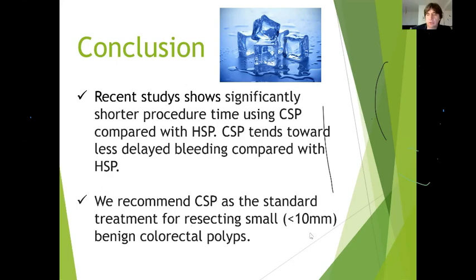From Dr. Roque Sainz: Do you diagnose and leave the small hyperplastic polyp? That's an old question. For a hyperplastic polyp less than 5 mm in size in the left sigmoid colon, I don't use cold snare polypectomy; I leave it. In the right-sided colon, sometimes I perform biopsy forceps polypectomy.